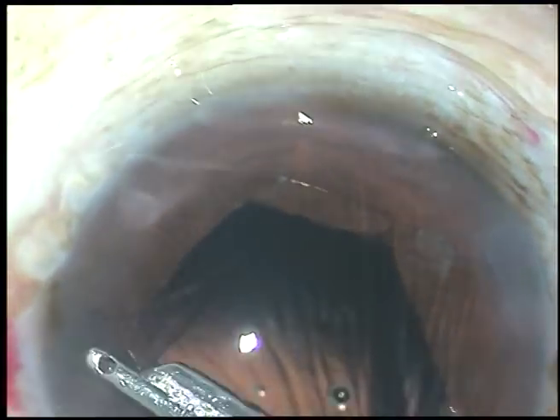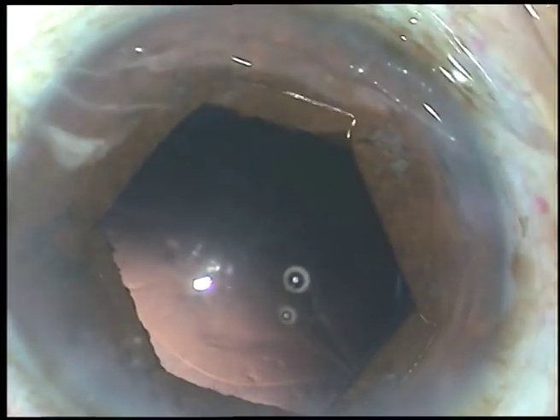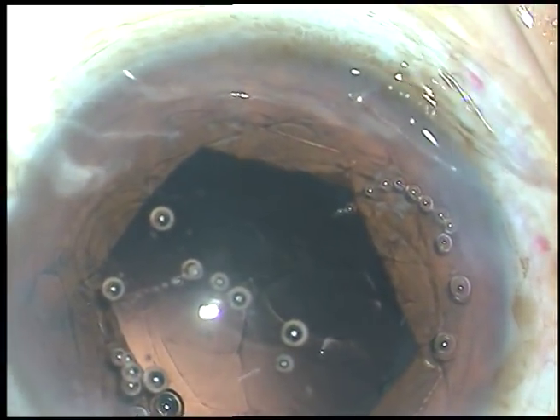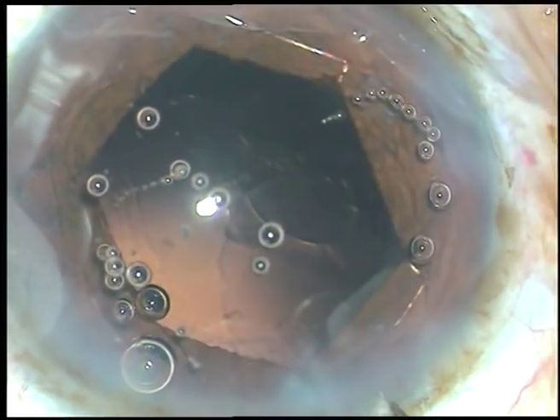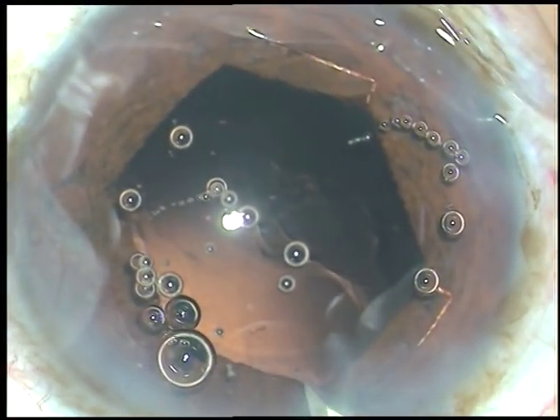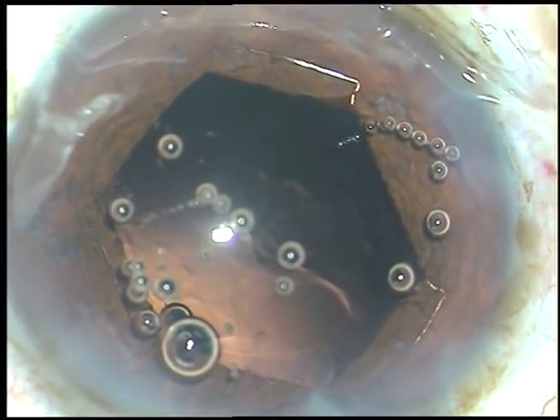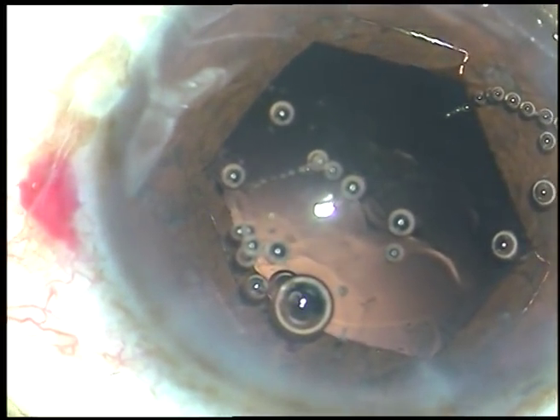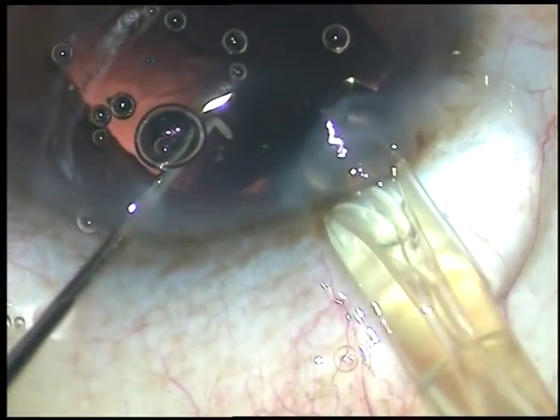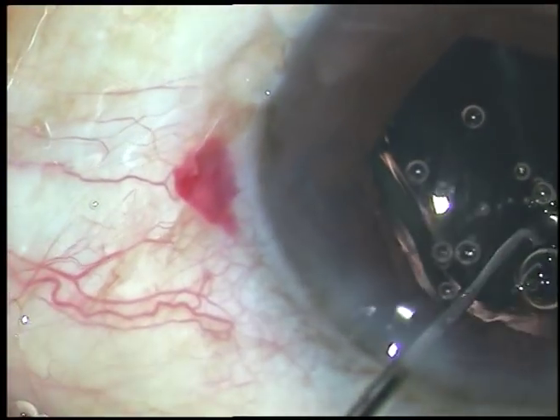The posterior capsule looks clean, so we can implant an intraocular lens. Viscoelastic substance is injected. A monofocal hydrophobic acrylic intraocular lens is being implanted — the cartridge is a B cartridge. I am enlarging the main incision by about 0.1 to 0.2 mm, so the incision which was 2.8 mm is now 2.9 to 3.0 mm. This lens is specifically the Acriol from Eye Care.